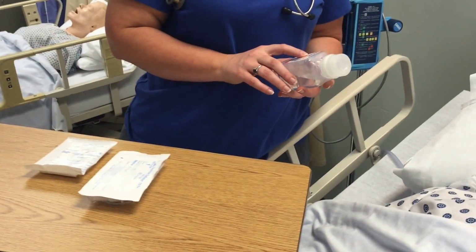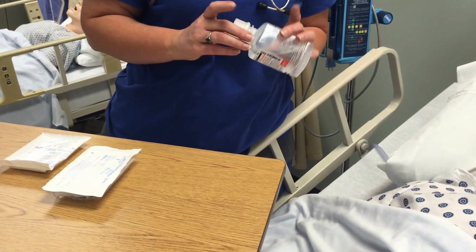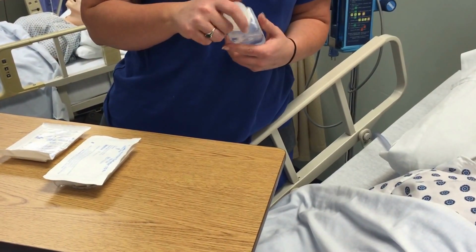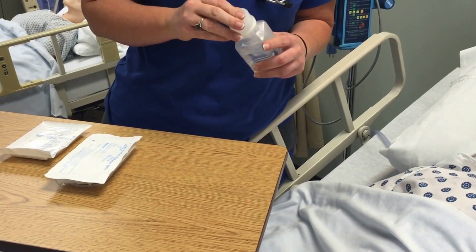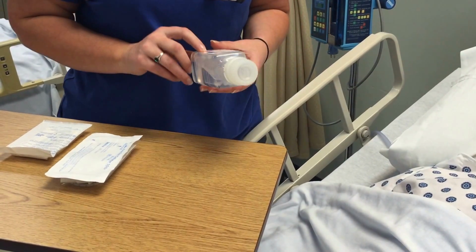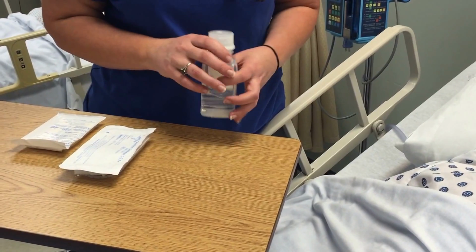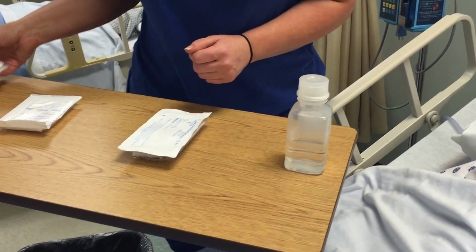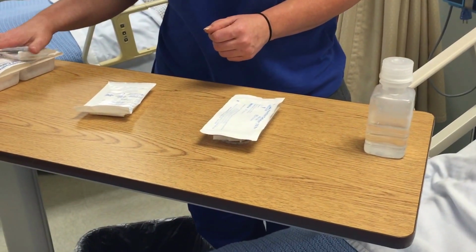So I want to inspect my bottle, make sure that it has not been contaminated of any kind, that it's still sealed. Even if it's been open, make sure the lid has been tight, it's not cracked in any places, and also that it is not expired. And it is a good bottle. All right, my sterile gloves. I'll set you all the way over here so you're not in the way.